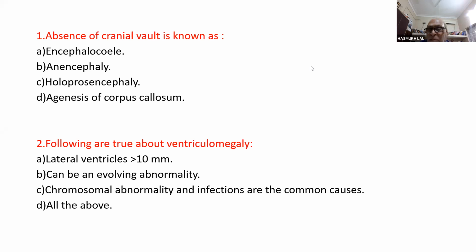And it is very, very important that we do not miss ventriculomegaly, because the incidence is almost 1%, and the implications are great if it is evolving dilatation. And I think this has an entire lecture in our SFM lecture webinar. So it's a very large topic.